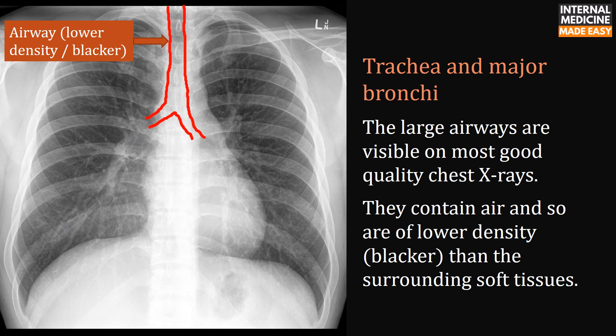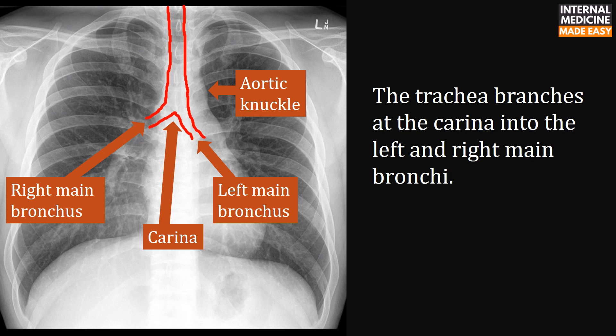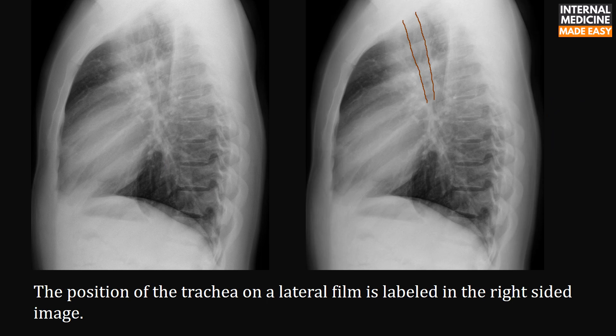The large airways — trachea and major bronchi — are visible on most good quality chest x-rays. They contain air and so are of lower density (blacker) than the surrounding soft tissues. The trachea is usually placed just to the right of the midline as it passes to the right of the aorta, but can be pathologically pushed or pulled to either side. The trachea branches at the carina into the left and right main bronchi. The position of the trachea on a lateral film is labelled in the right-sided image.